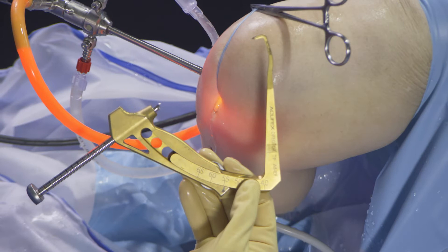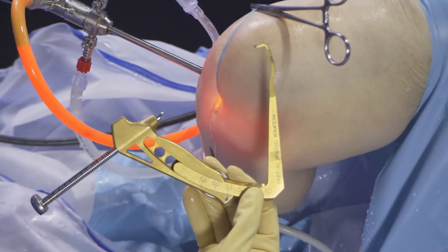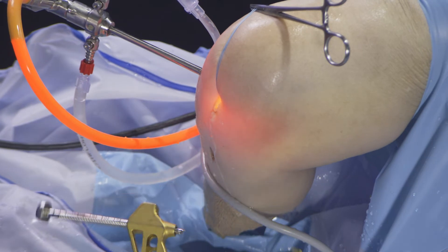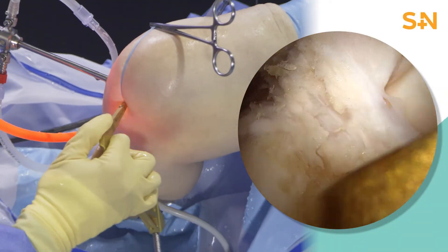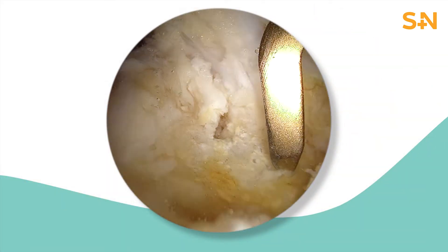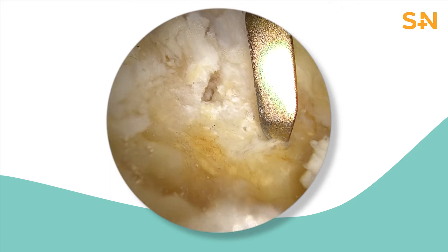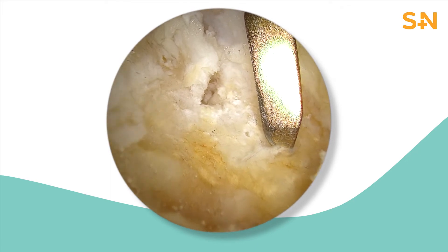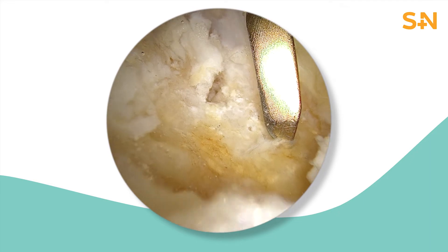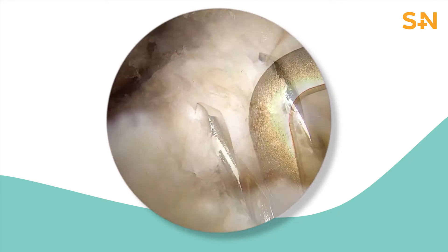At this point, your choice of tibial guide can be used. In this example, a tip-to-tip adjustable degree guide is used with a guide pin and barrel reamer sized to 10 mm. The tibial guide is positioned at the ACL footprint between the tibial spines adjacent to the anterior horn of the lateral meniscus, and approximately 10 to 11 mm anterior to the fibers of the PCL.